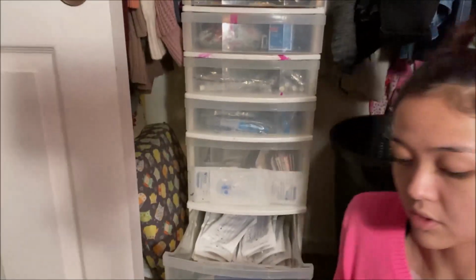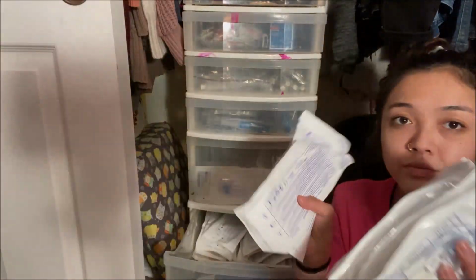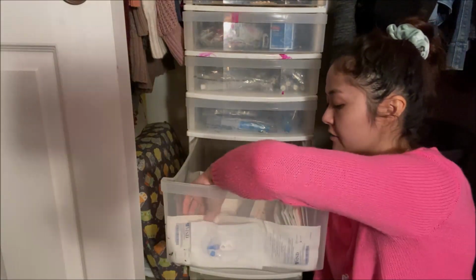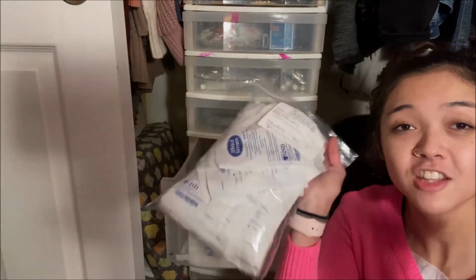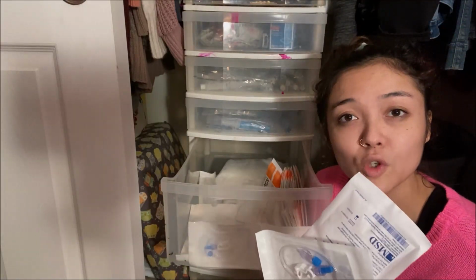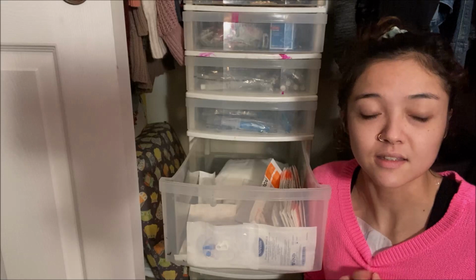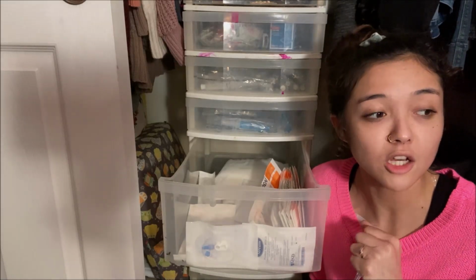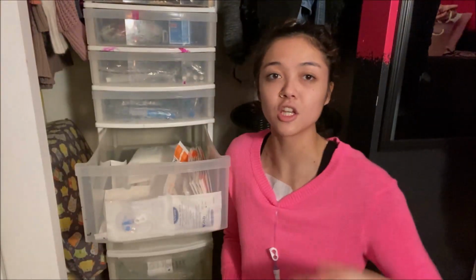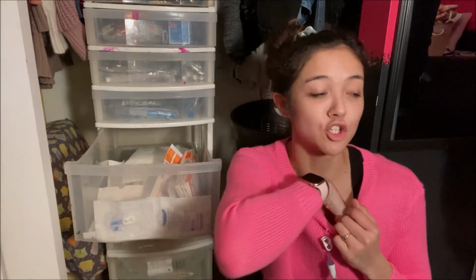And I actually have to load the ones that I just got. In here I have a bunch of extensions. All of these are kept in there. I don't know why they keep sending me extensions because I told them I don't need any more. I was using them at first in the winter because my line is a little bit less accessible, especially with a coat on. The extension made it so that my line would come out a little bit lower instead of having to dig into my shirt.